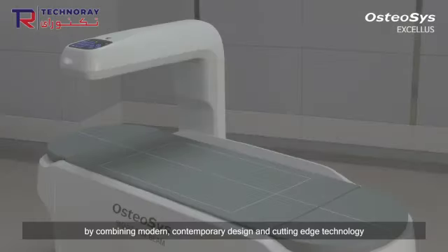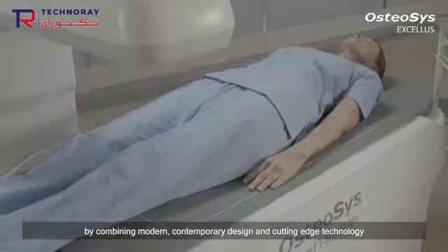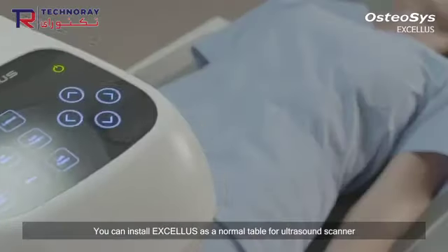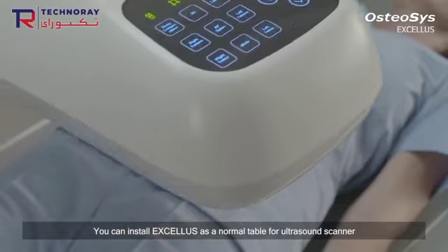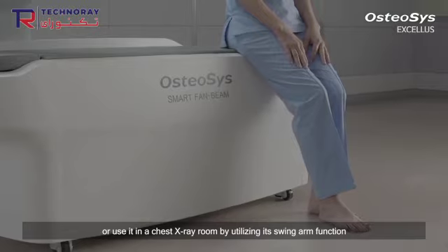We enhance both the beauty and convenience by combining modern, contemporary design and cutting-edge technology. You can install EXCELLUS as a normal table for an ultrasound scanner, or use it in a chest X-ray room by utilizing its swing arm function.